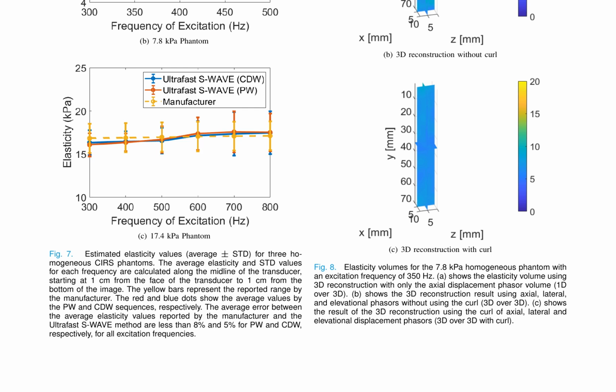The implementation of curl in the reconstruction process further improves the accuracy of the estimated elasticity values. This study contributes to the development of a non-invasive imaging technique capable of providing high-resolution elasticity maps in real time, significantly impacting the field of medical imaging and diagnostics.